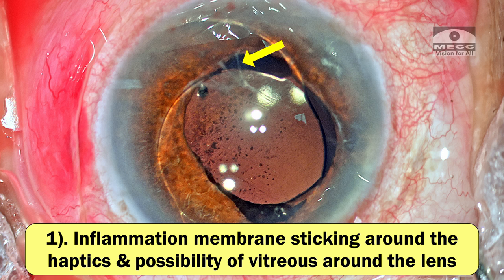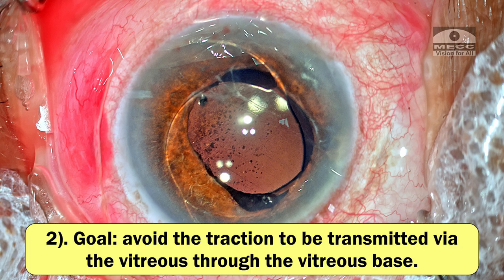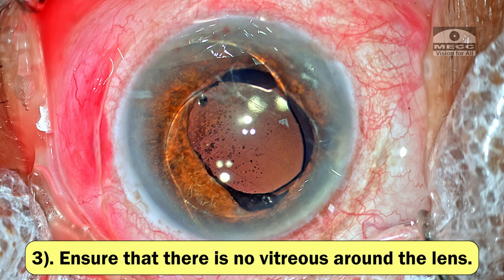The lens is stuck there for quite some time. There's inflammation and it could be having membranes sticking around the haptics, and more importantly, there's always a possibility that vitreous would be around it. If I'm trying to pull the lens out, I don't want any traction to be transmitted via the vitreous fibers to the vitreous base. So before explanting the lens, I want to ensure that there is no vitreous around the lens. If there is vitreous around the lens, I would like to take care of it first before touching the lens and pulling it out.